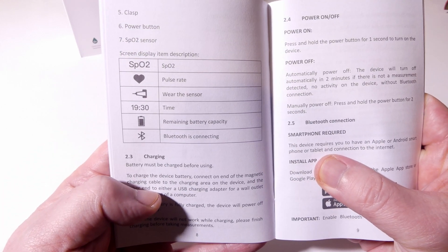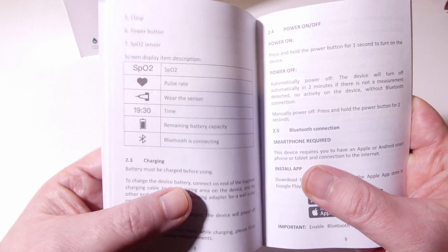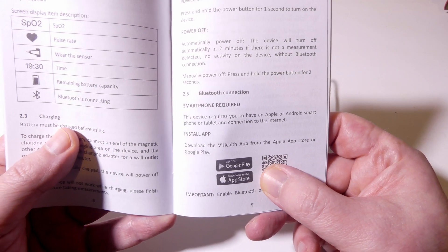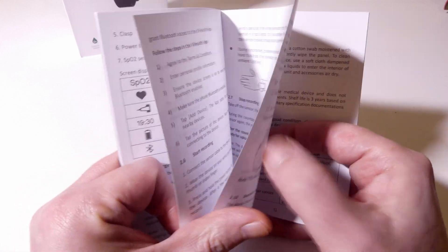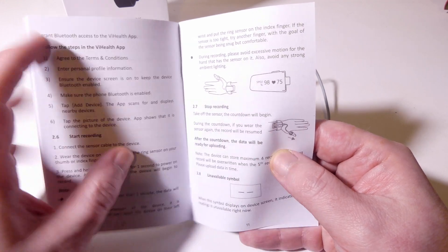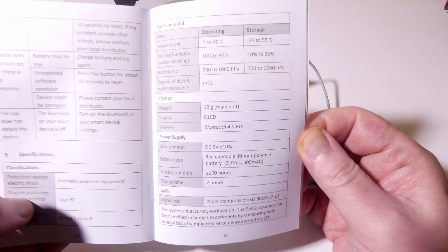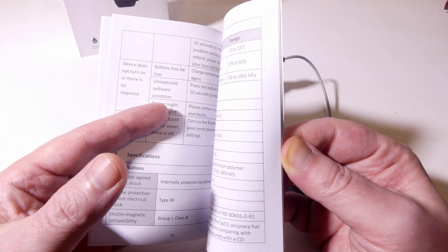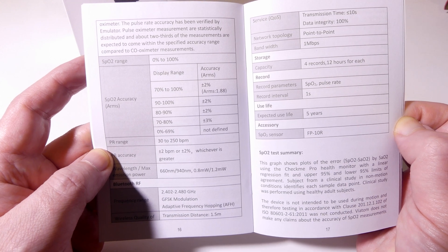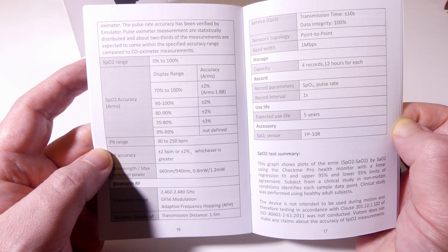The manual covers screen display descriptions such as SPO2, pulse rate, and putting the sensor on when you see that icon. You do have your time in military format, which cannot be changed. You have your remaining battery and a Bluetooth indicator showing whether that's connected or not. You can use the vHealth app, available in the Google Play or Apple App Store. It's showing you how to put this on — it is meant for your left wrist, and you can put the sensor on your thumb or forefinger. Specifications show up to 100 hours of runtime on a two hour full charge, with SPO2 accuracy of plus or minus 2%.